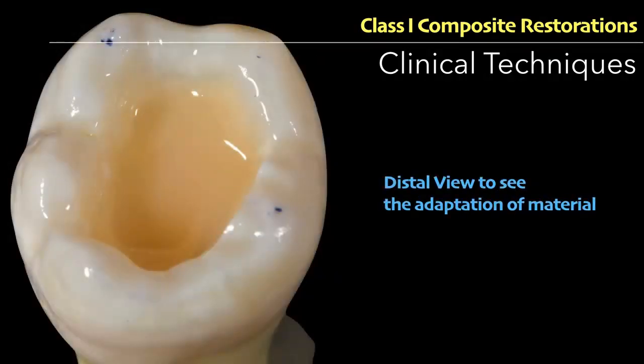In that picture you can see, from the lateral view of your restorations, that there is no gap, no shrinkage, and it adapts well. When you have such beautifully adapted restorations, your patients never complain about sensitivity or dislodgement of the filling. But for that you need magnification. In clinics we often don't have magnification, so we have no idea where the composite or the flowable is going. So you need training with magnifying loupes and a microscope.